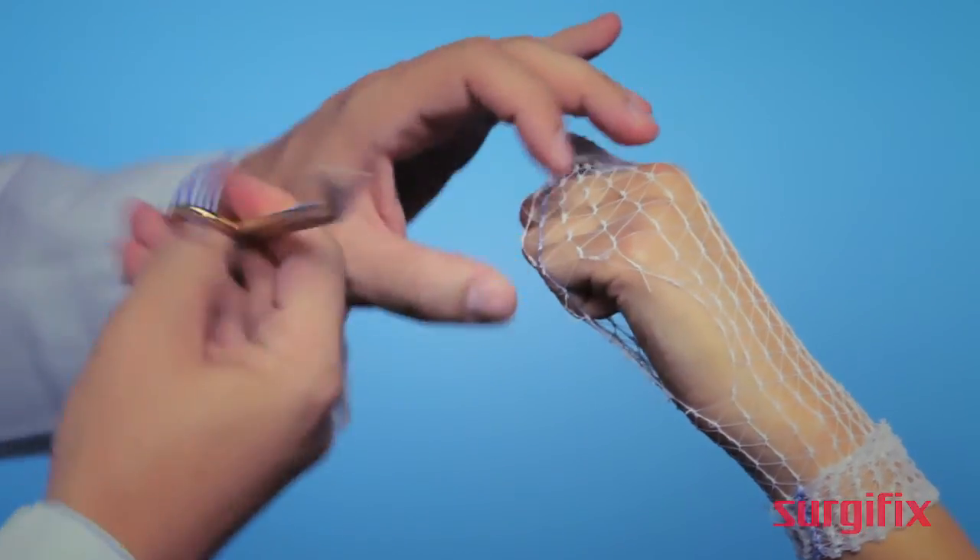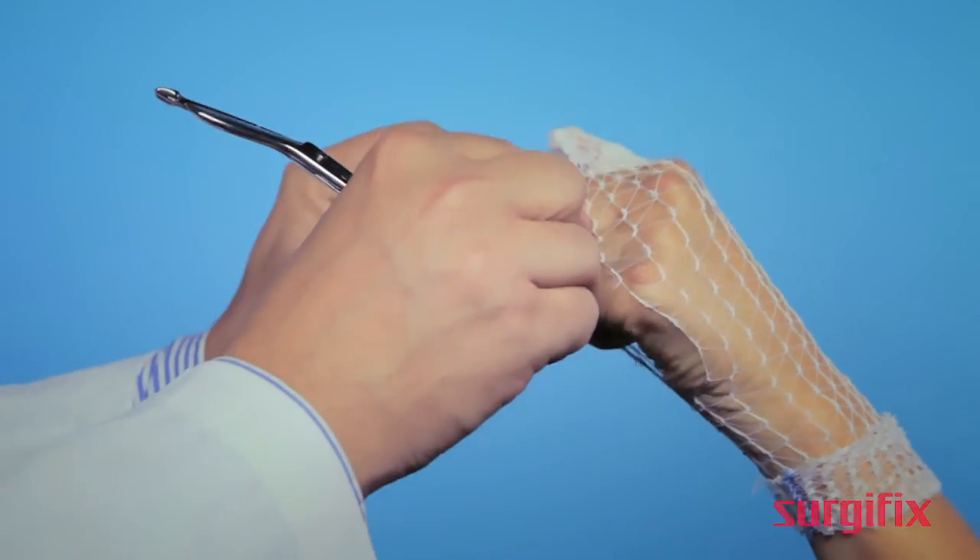Cut the dressing on the back side of the hand, and leave fingers without dressing free to move.